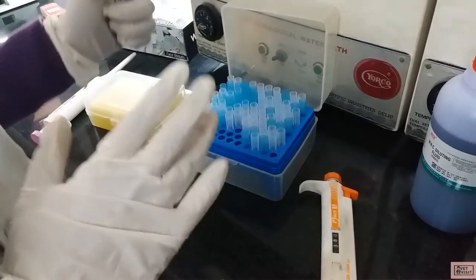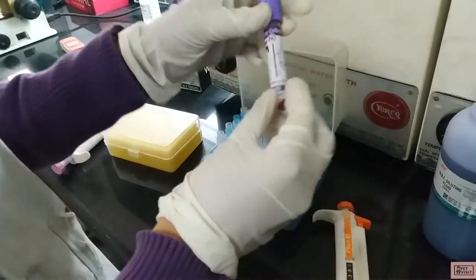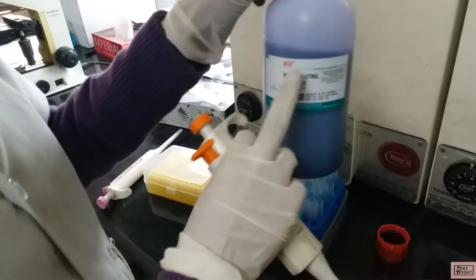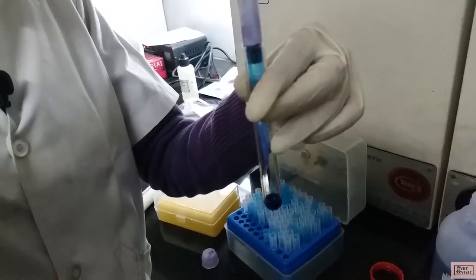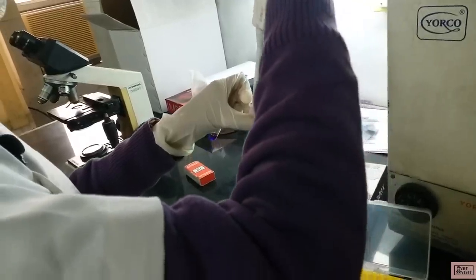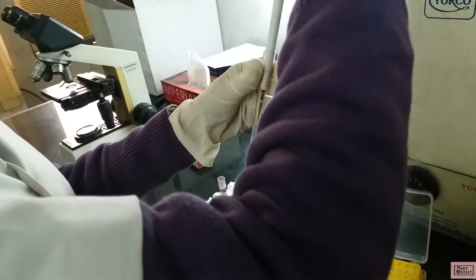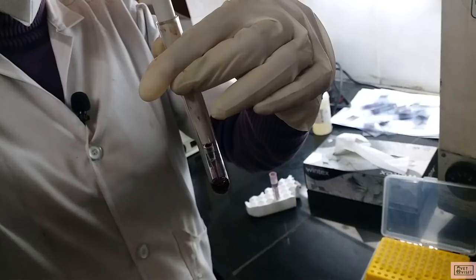For our first procedure, which is TLC — that is total leukocyte count — we have our blood sample here. First we have to mix our blood sample gently but thoroughly. Then we have to take 380 microliters of WBC diluting fluid, which is TLC fluid, into a dry test tube. Next we will take 20 microliters of a thoroughly mixed blood sample and we can wipe off the pipette with tissue paper for any excess blood.